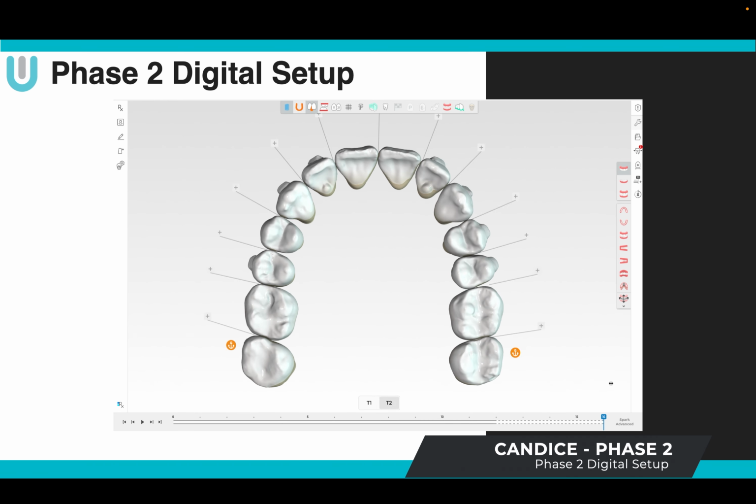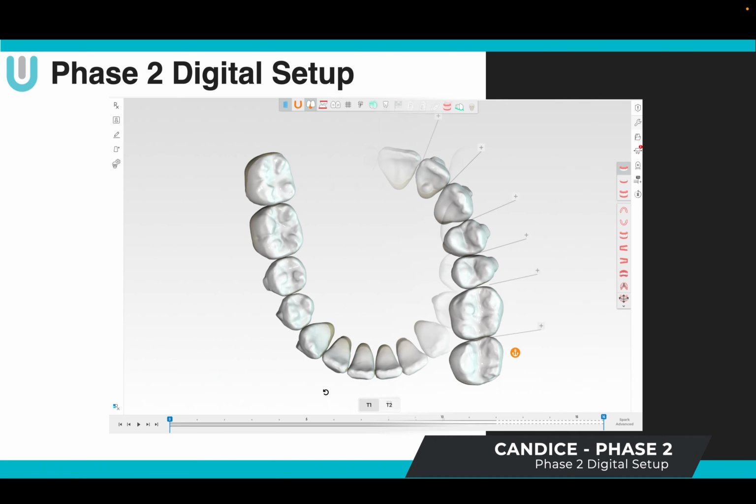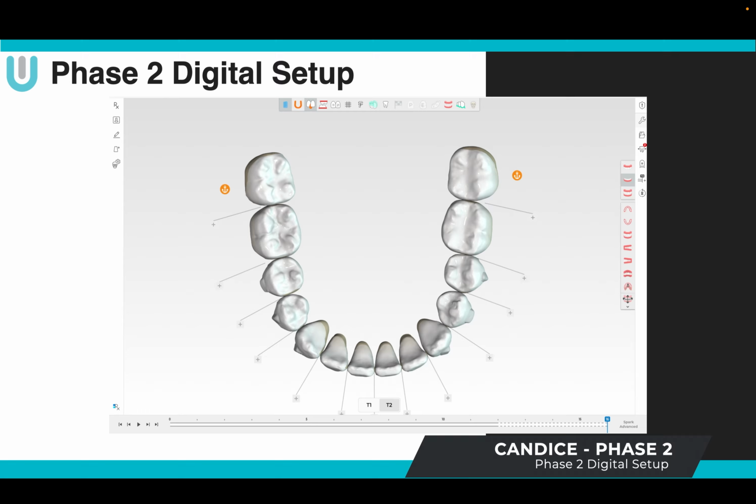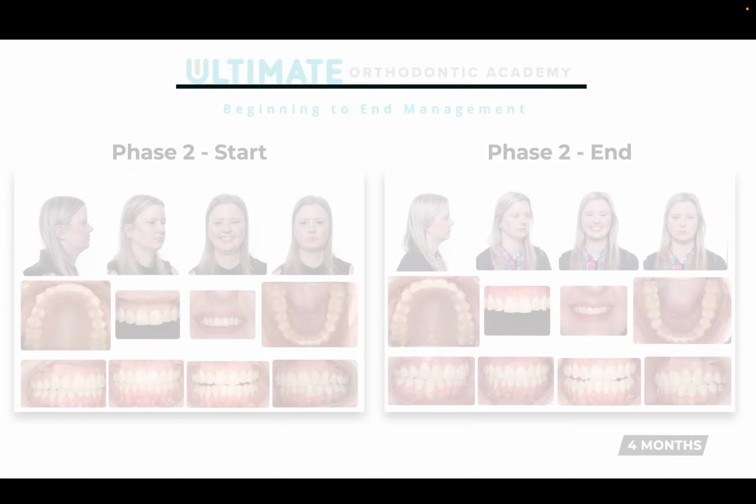So in this case, we've got about 12 active aligners. I always add 4 passive aligners. Those are just basically aligners that don't do anything so that the patient can change every week, stay on schedule, keep clean aligners while I'm waiting for the next set of aligners to come in, which typically takes about 2.5 to 3 weeks from scan. But again, with scheduling, sometimes that takes 3 or 4. And I don't want patients coming in with dirty trays yelling at me that we're running behind or that we were delayed, because we want to make sure that we're always hitting our mark.